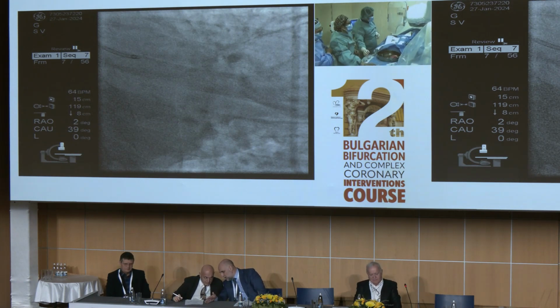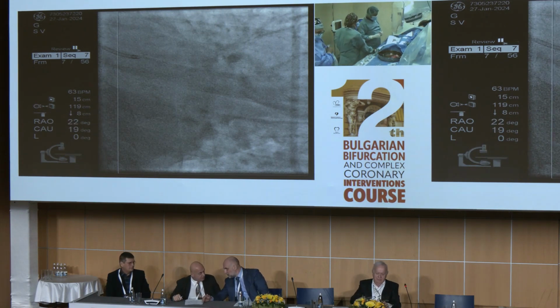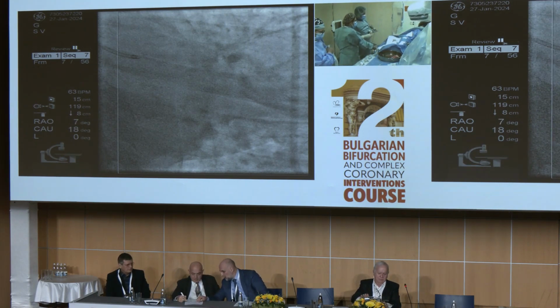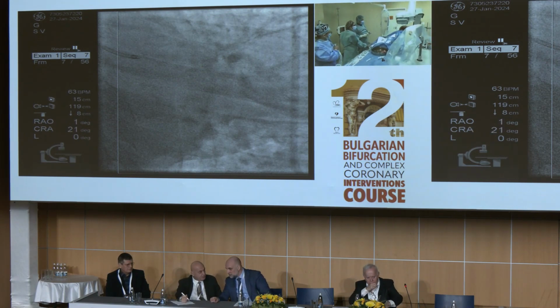So my suggestion is going back to the 35 degrees. In the 35, you control. Yeah, I see, this is the controller here. I see. So 35 cranial. That's why I could not move the system.